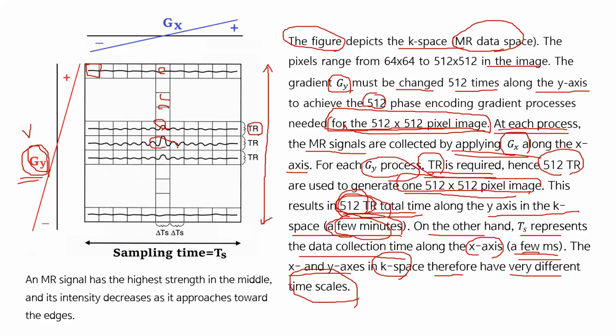In the y direction, the time scale is about a few minutes, but in the x direction, total time is just a few milliseconds.